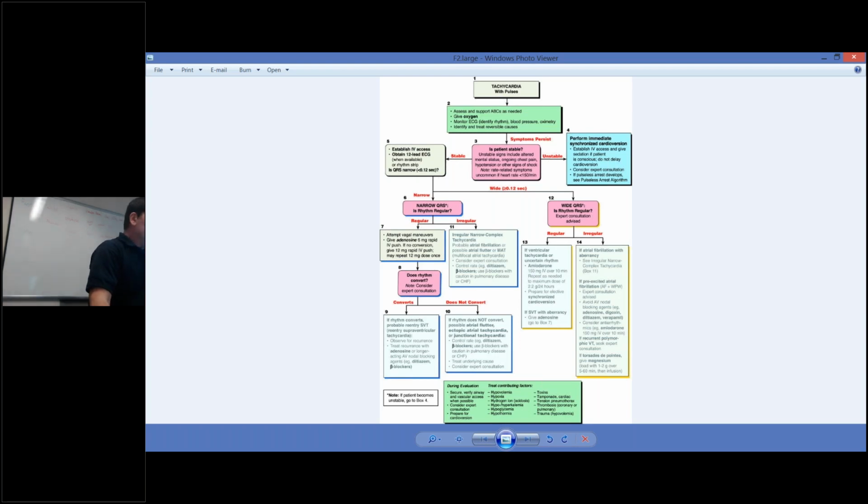So on my screen next door, you guys were looking at, you can follow this pattern on here. You can see my arrow on the screen. So just follow this area. It'll tell you if it's wide, if it's narrow, different things that you'd be doing. This is another version you can go down. So look at that as well.